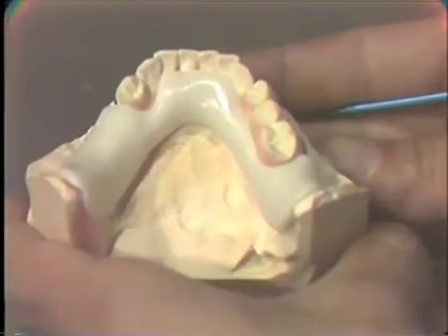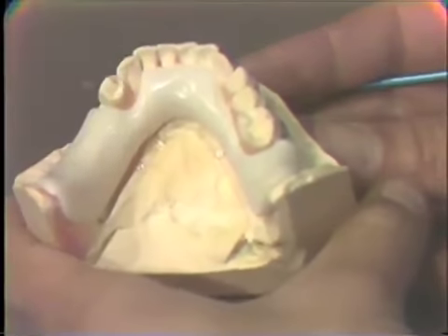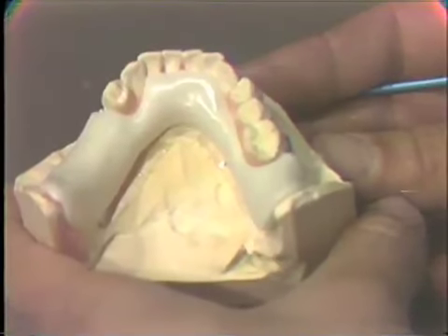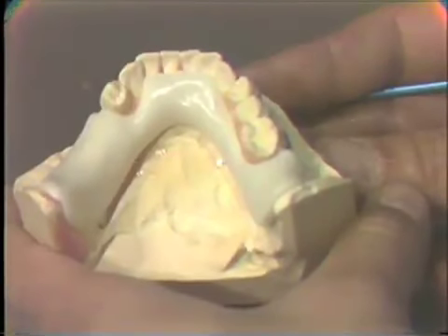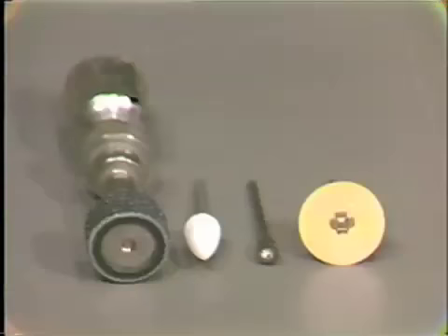We see here the finished jaw relation record base. Now the finishing sequence for the acrylic in the rough state would be to use these following instruments.